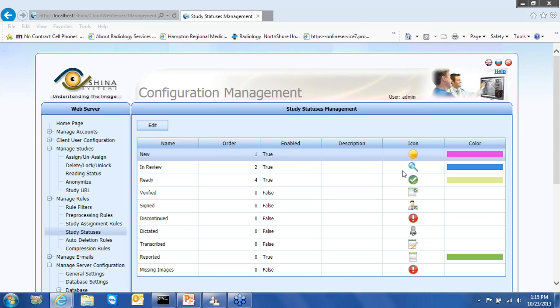The first question is probably for Sharon here. What are the benefits of rules-based routing? Benefits are that we can preset those automatic rules as we install the system.